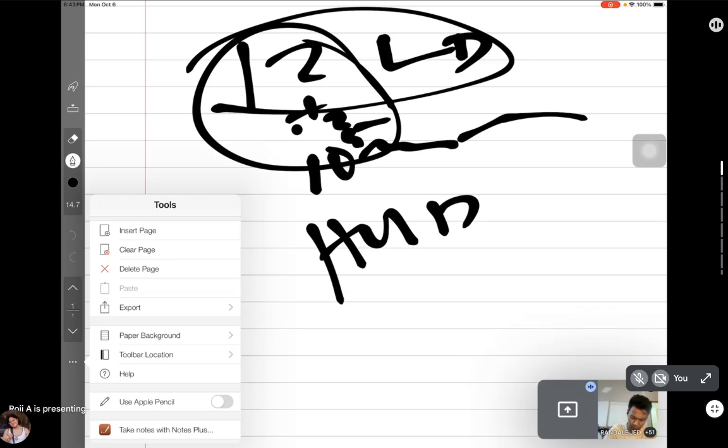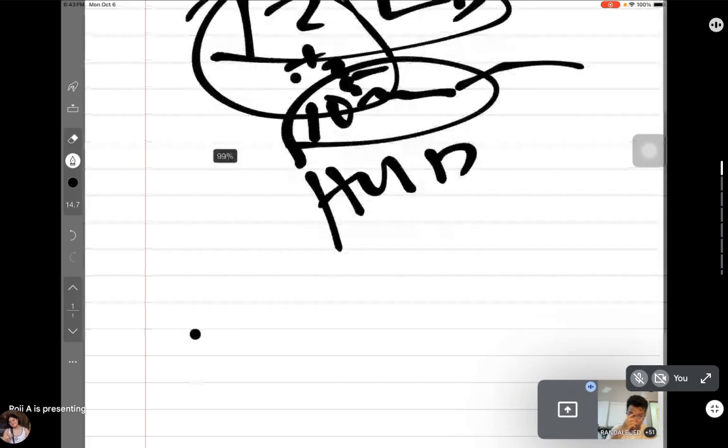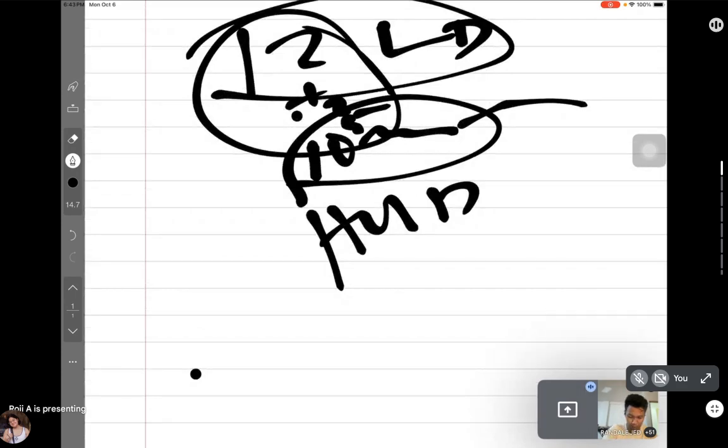For example, this is 12, meaning to say your HVID is 10. So if you order a contact lens, you must look for a 12 to 12.5 LD, correct? Do you follow? This is good.